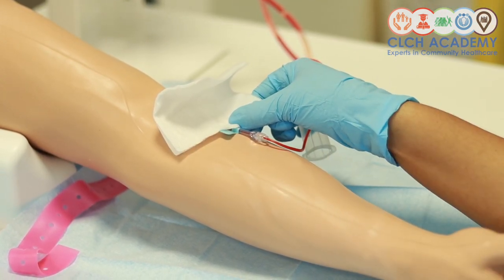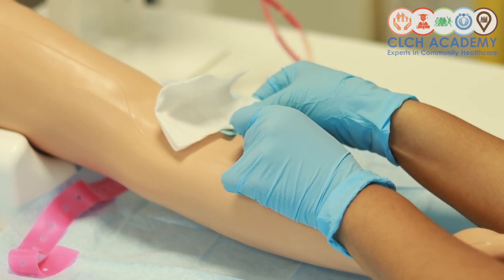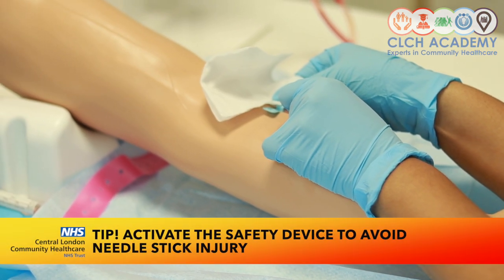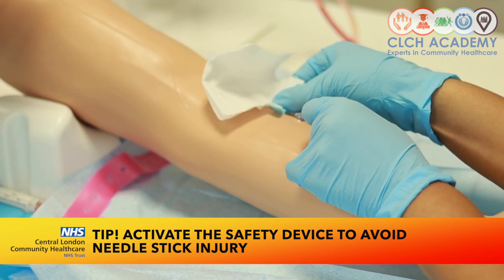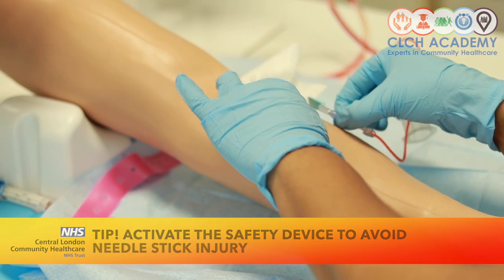Whilst I'm still holding on to one wing, I'm going to activate the safety. Can you see that bit? Yeah. Okay. So I'm going to squeeze the sides of my blood collection safety device, withdraw and retract. I hear that click. That tells me my sharps device is safely sheathed.